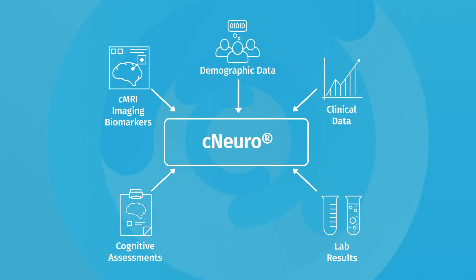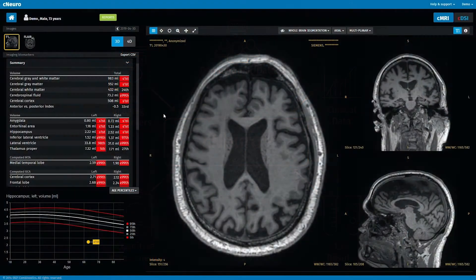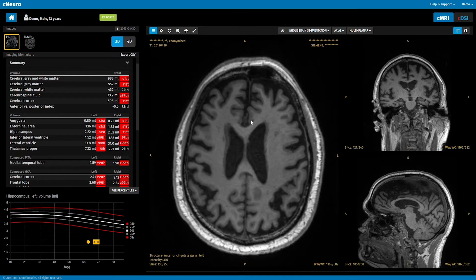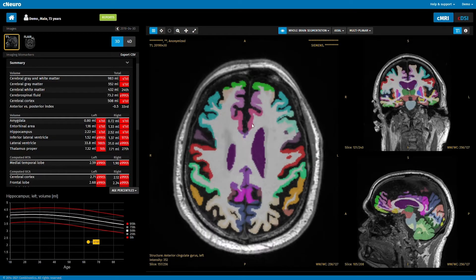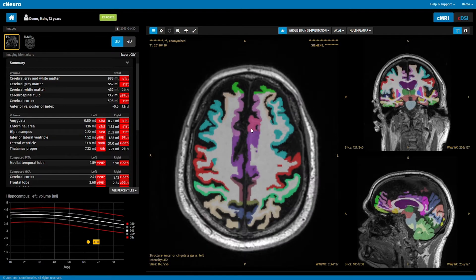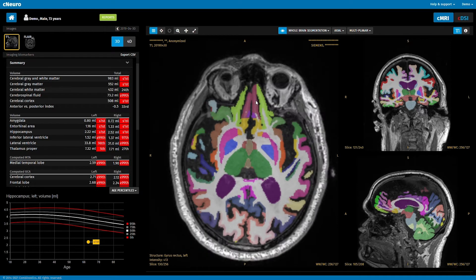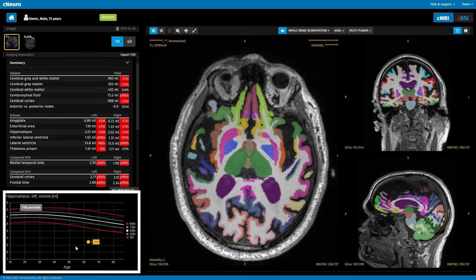CNeuro-CMRI is a tool for quantitative analysis of MRI brain scans. Based on T1 images, CMRI segments a large number of brain structures, as shown with the colored overlay. Volumes of structures are computed and compared with reference data from healthy individuals.